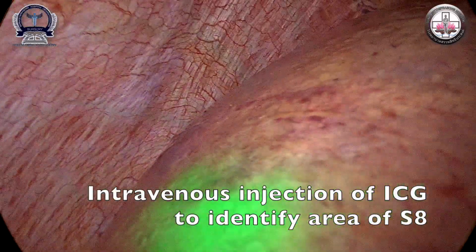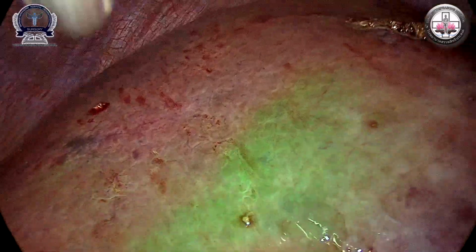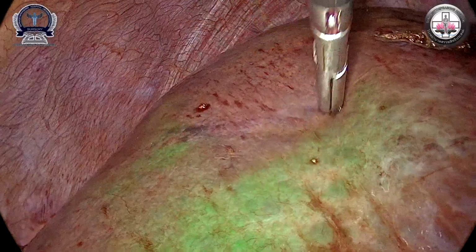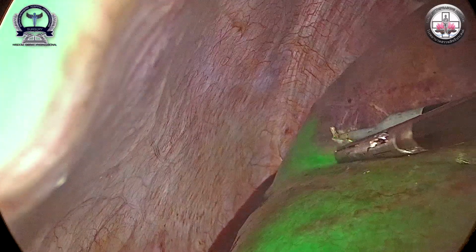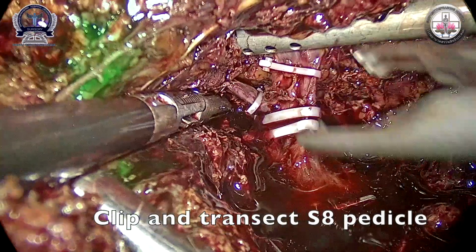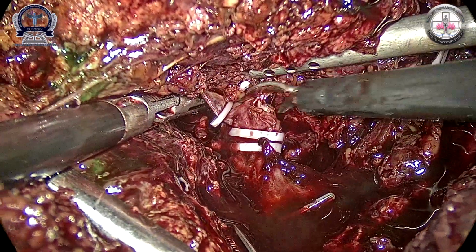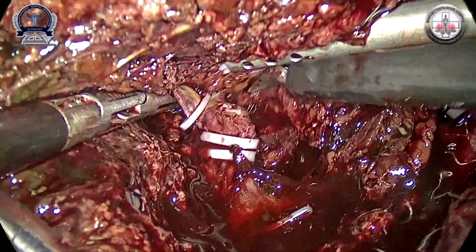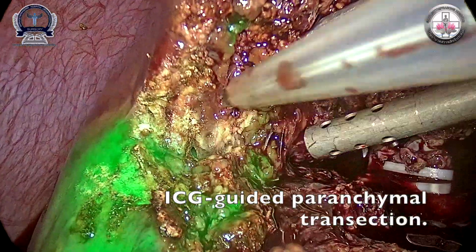Intravenous ICG was injected into the patient to identify the true anatomy of segment 8. Clipping and transection of the segment 8 pedicle were done. ICG-guided parenchymal transection was performed.